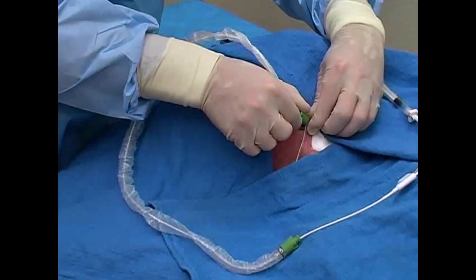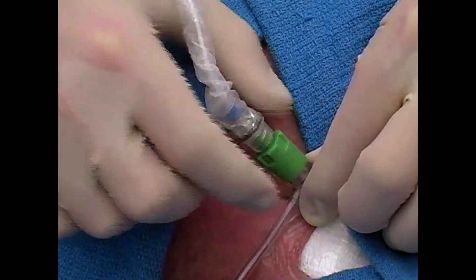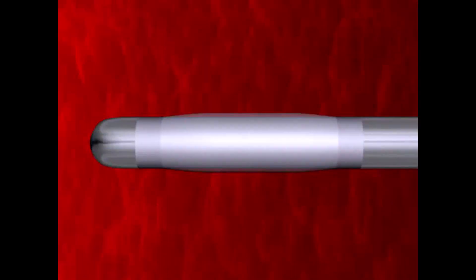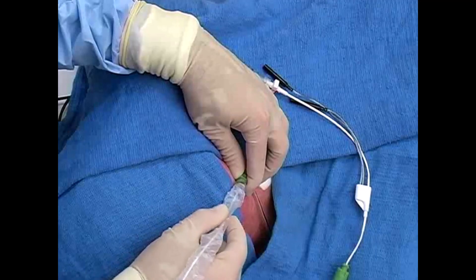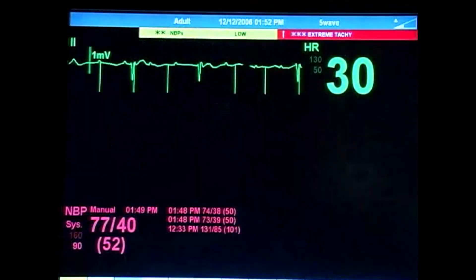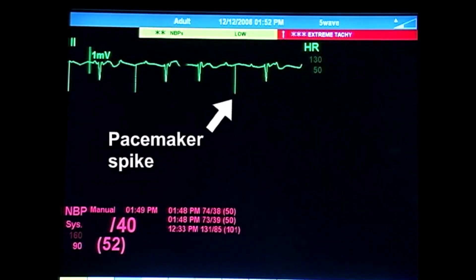If your sheath introducer has a closable valve, make sure it is open by turning it counterclockwise. Inflate the balloon with air and close the gate valve. The balloon is designed to float the catheter, along with the venous blood flow, into the right ventricle. Advance the catheter through the introducer quickly and smoothly. Watch the EKG monitor during advancement of the wire. At this point, you will see pacemaker spikes overlying the patient's native rhythm, but there will not be signs of capture.